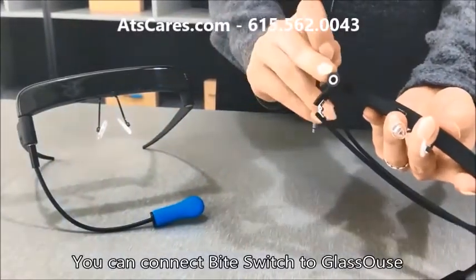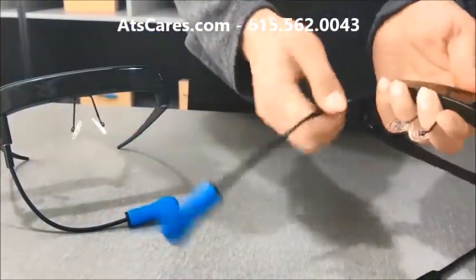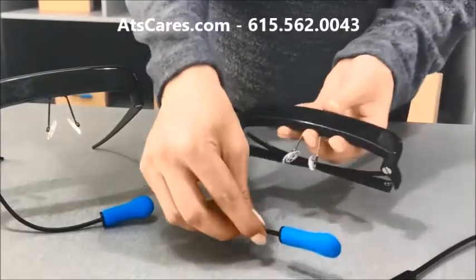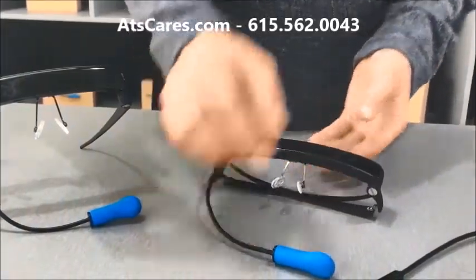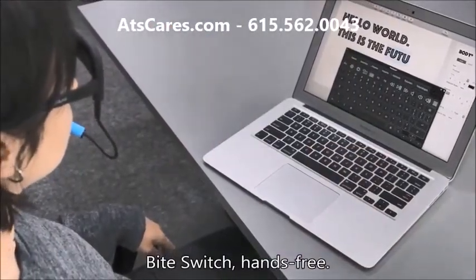You can connect Bite Switch to GlassOuse through a 3.5mm jack. Simply plug it in and adjust the wire. You can do the clicks by biting the switch module of Bite Switch hands-free.